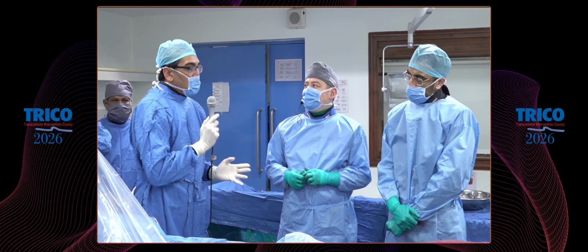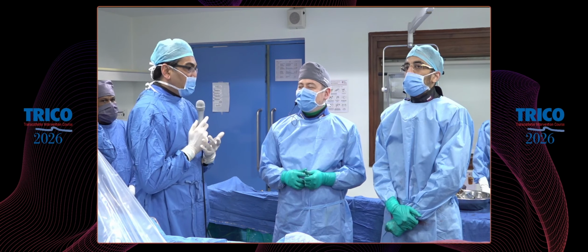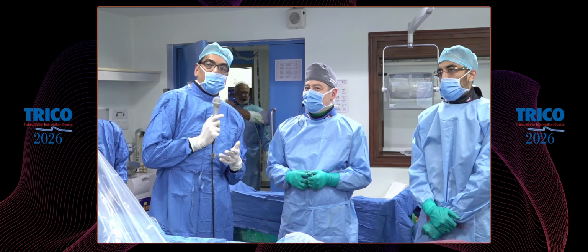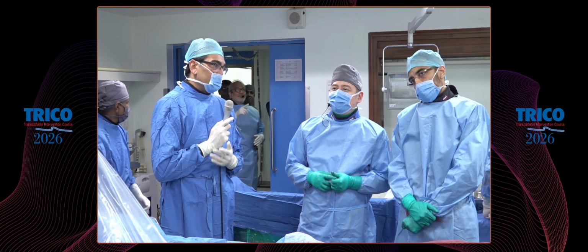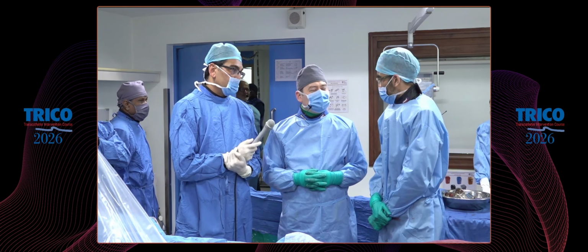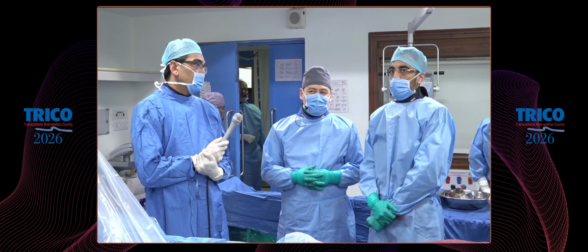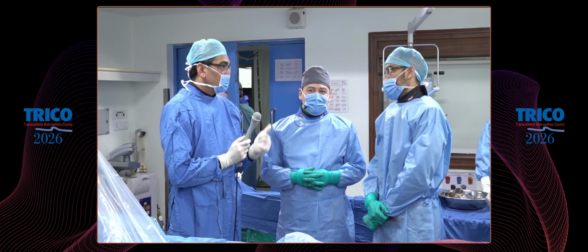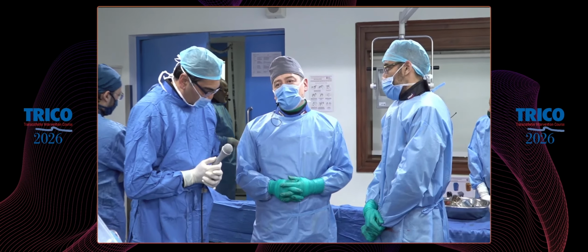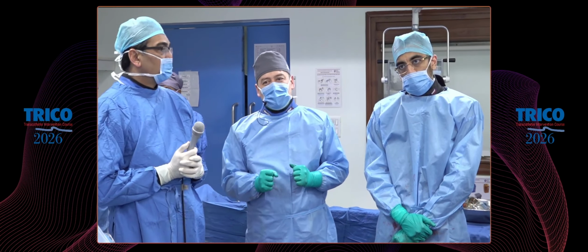The question is, if we have access to the self-expanding valve, in this bicuspid aortic valve stenosis, which are the cases where you select a self-expanding valve over the balloon expandable valve, or vice versa? So normally in patients who have a small annulus and lesser need for coronary access, probably in the long run, we can think about a self-expanding valve, or if the coronary heights are very good. And it is also very important to mention that a self-expandable valve for a patient with a bicuspid aortic valve is much safer and has better hemodynamics.